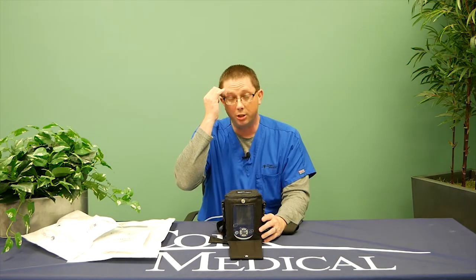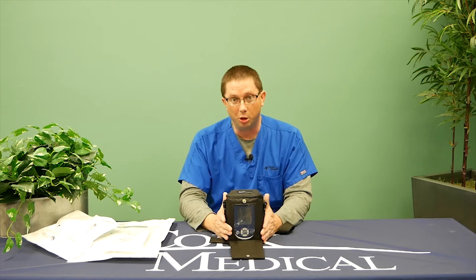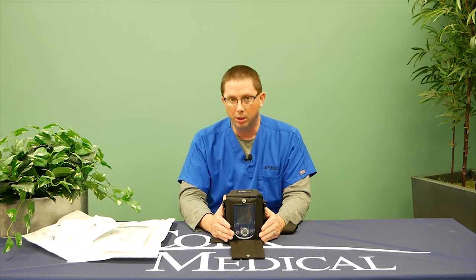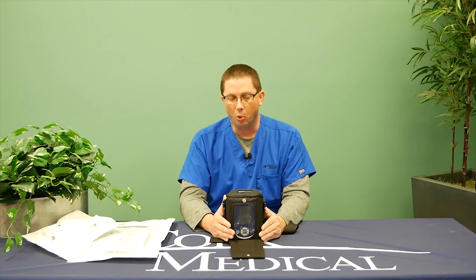Some common questions and answers about negative pressure wound therapy. How long will this device take to heal my wound? That depends on your wound condition, the etiology of your wound, and the location. On average, most patients wear this device from one to four months, depending on wound progression.